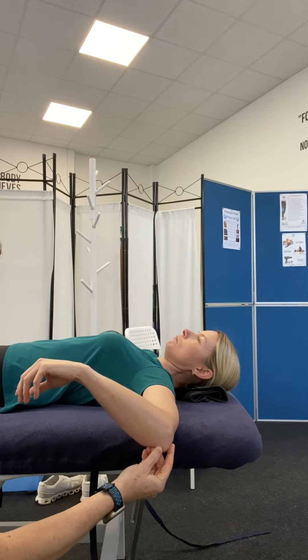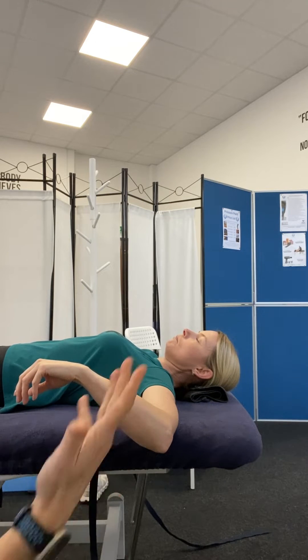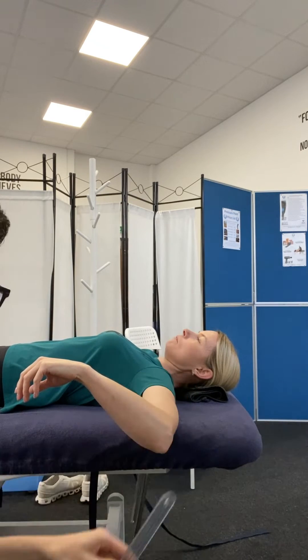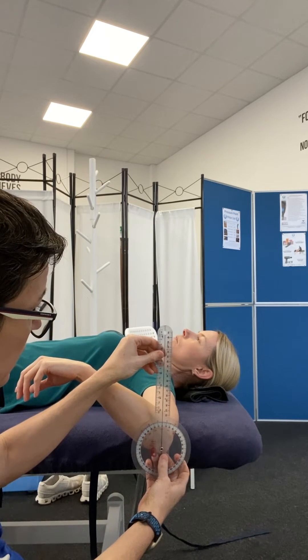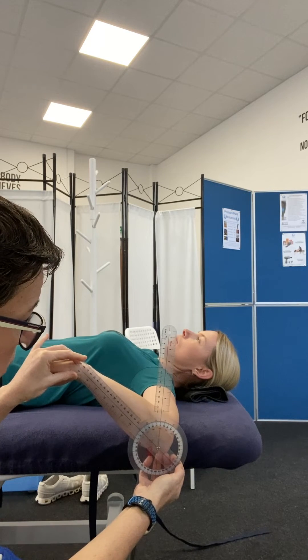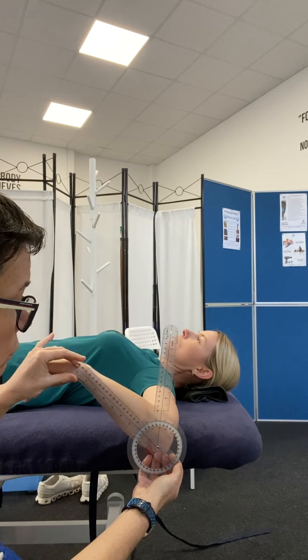Once we get to that end range, the client should stay where it is. Now you've got two hands to use your goniometer. The central point here, I'm going to place on the olecranon process. One arm goes up to the ceiling or vertical, and the other arm of the goniometer goes to that ulnar styloid process. So for medial rotation here, we've just gone through 52 degrees.